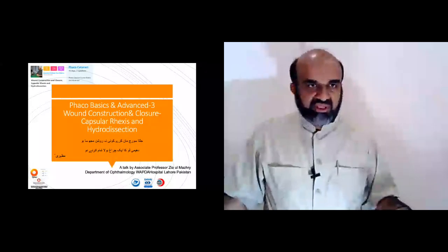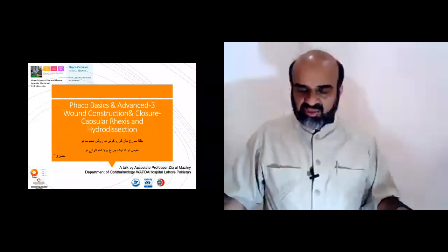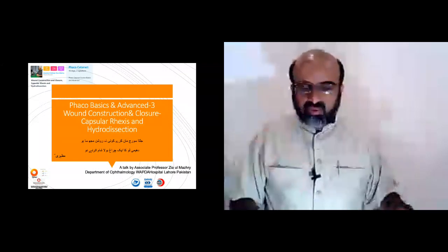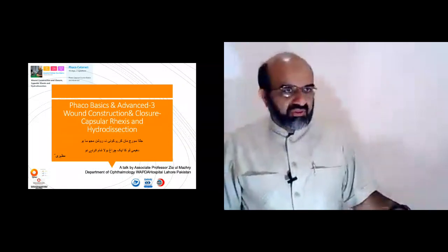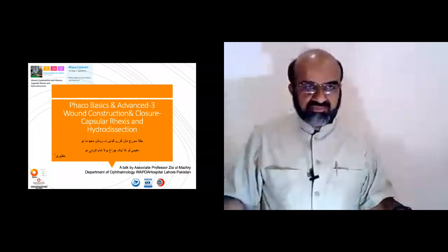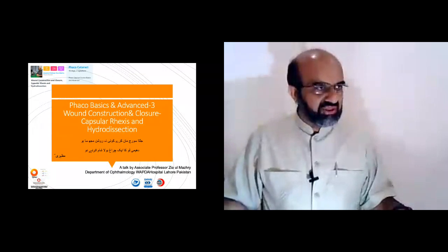In this phaco cataract basics and advanced course part 3, we are going to discuss in today's lecture wound construction, closure, capsular rhexis and hydrodissection techniques.